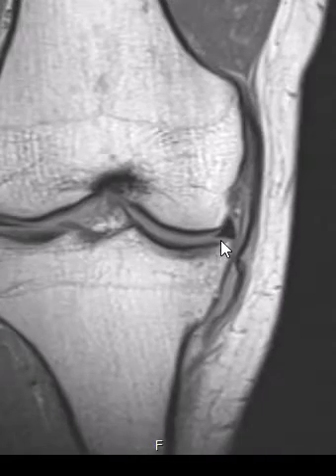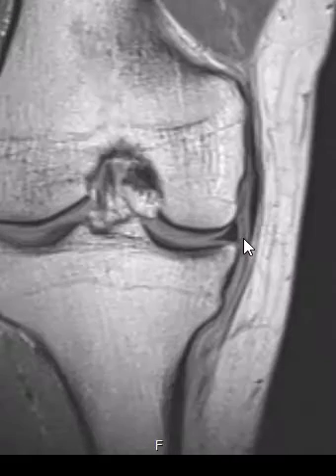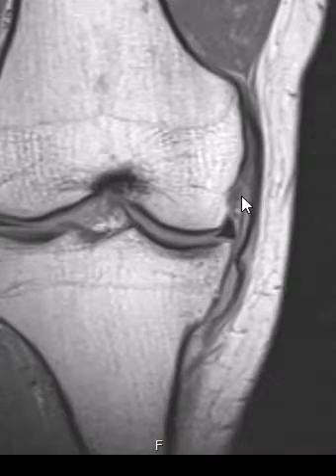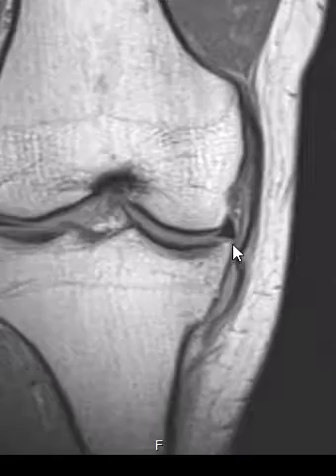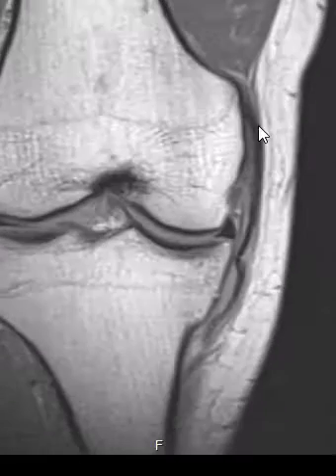The inner capsular fibers are adherent to the medial meniscus, and usually they are stuck right together. I can see there's a little bit of separation there, so there's an injury of the medial meniscus capsular junction. That little linear band — it looks like the capsular fibers are maybe partially torn or partially separated from the medial meniscus body. But the main thing is the outer fibers.